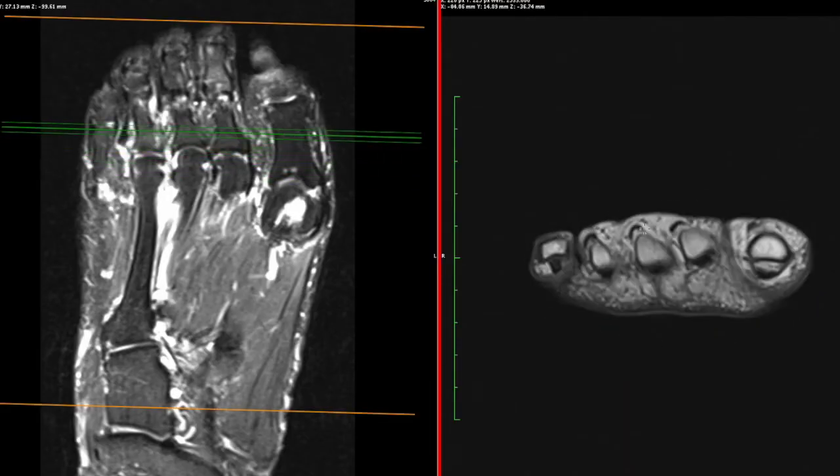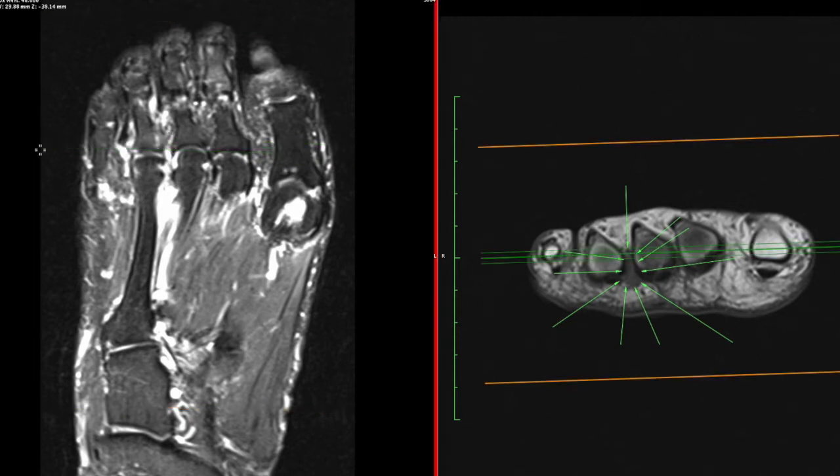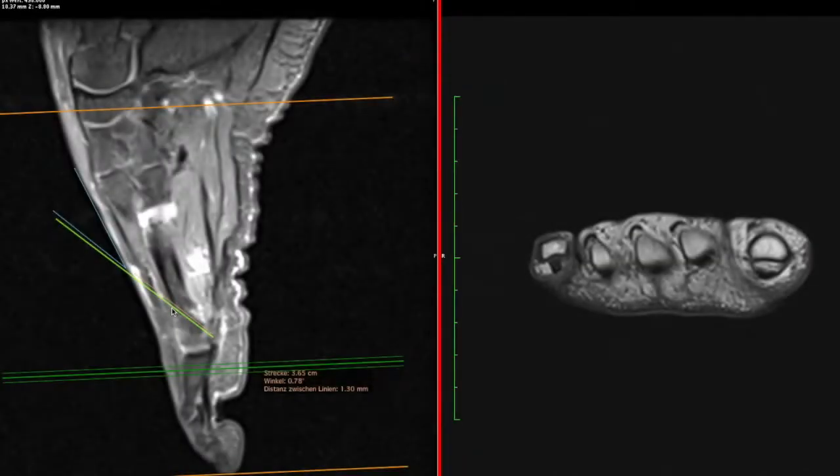Here I locate the Morton's neuroma which is approximately at the joint line of the MTP joints, sometimes a little bit distally. But if I am unsure I rather inject proximal in order to destroy the complete nerve. Here you see the 25 degree angle and the length of my injection needle which should be 3.7 cm from the skin to the Morton's neuroma.